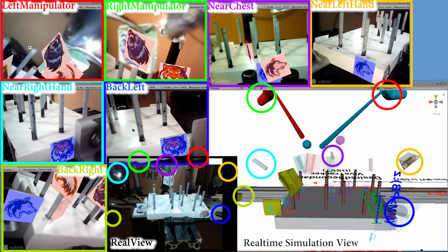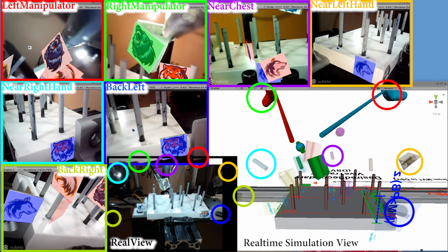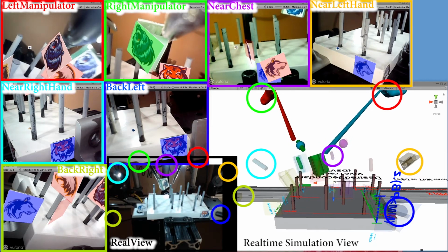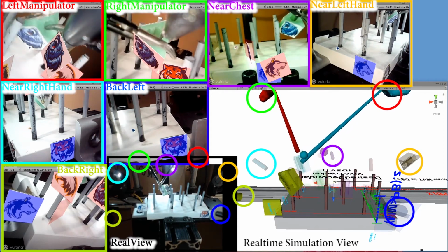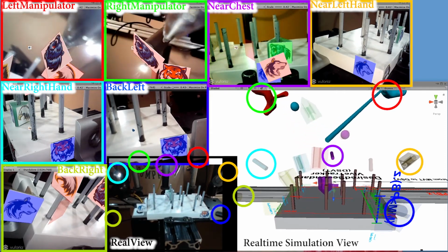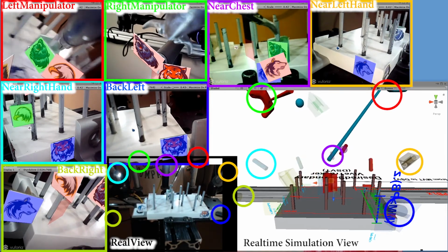One thing that I did notice when I was testing this was that the left manipulator seems to be calibrated a little bit better in terms of where the endoscope is predicted to be on the shaft. I don't know if it's because I more accurately placed the marker or if I more accurately measured it, but it did seem like when I let go of the donut on one of the pegs, it let it go in a more accurate position.